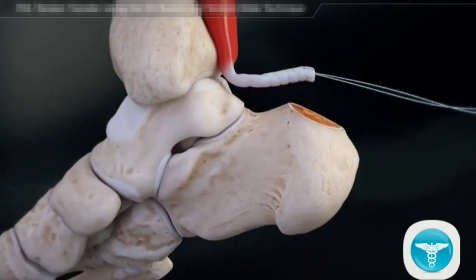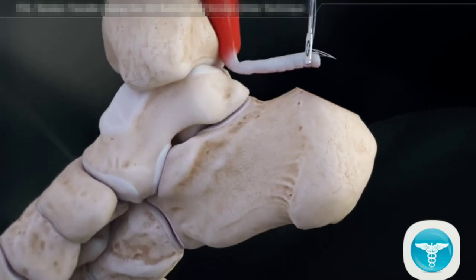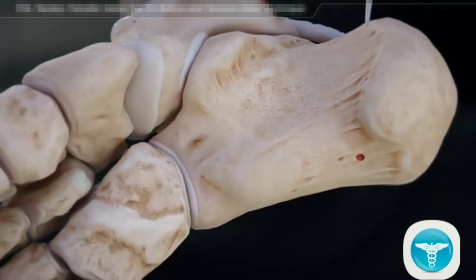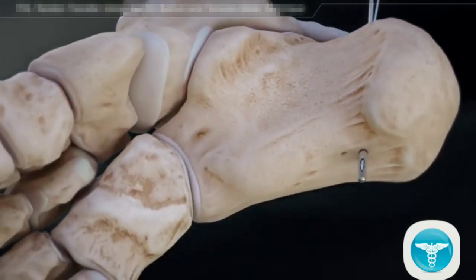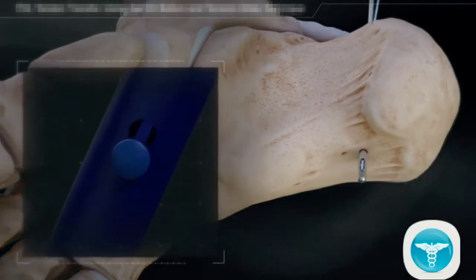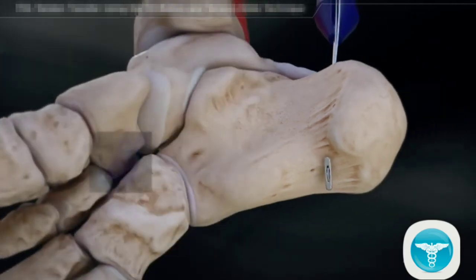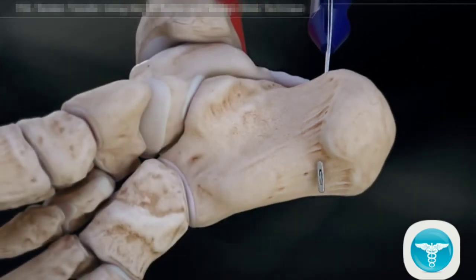Hold tension on the suture limbs and insert the tip of the button inserter into the button. Hold tension on the sutures and insert the button through the calcaneus under fluoroscopy, ensuring it is deployed through both cortices. Pull the lever back on the inserter handle to release the button. Note, leave the button inserter in the hole when pulling tension back on the button.